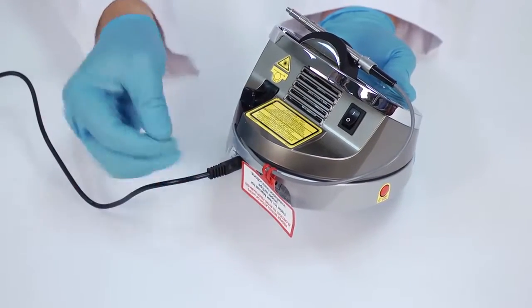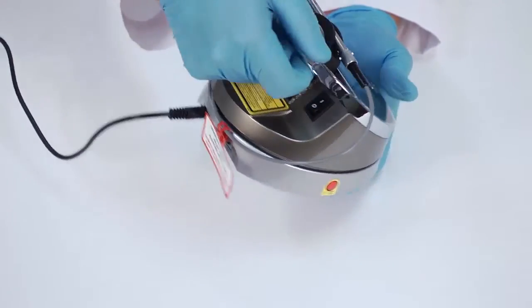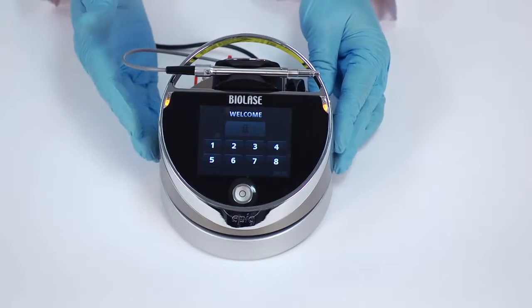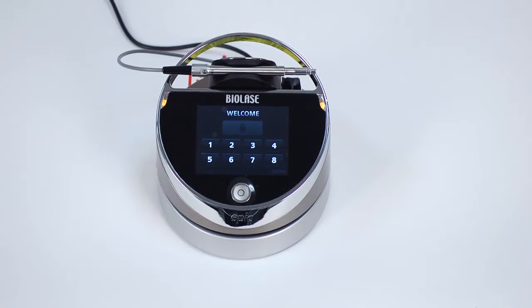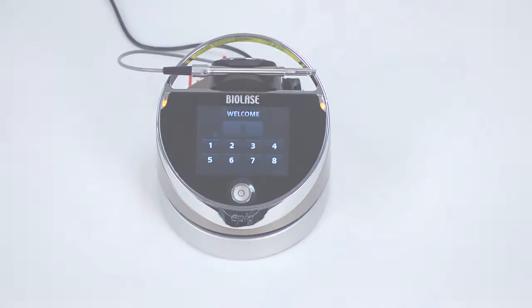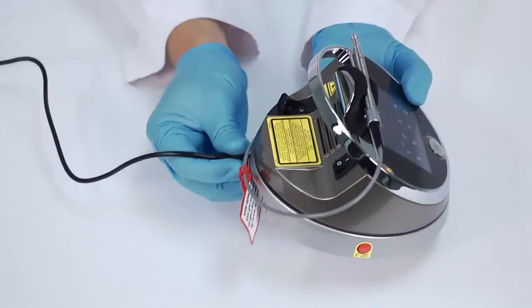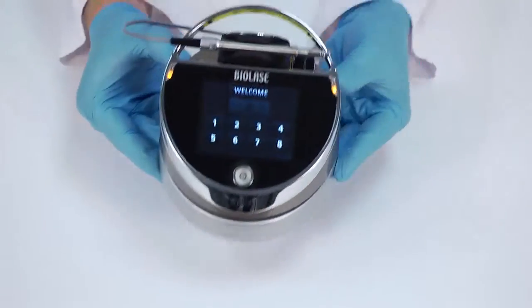To fully charge the battery, plug the power supply in and then turn the laser console on at the power switch. The laser console will start to charge and the unit will go into sleep mode, with the screen off, after 5 minutes. If the power supply is plugged in but turned off at the power switch, the battery will still charge but at a slower rate. Once the battery is charged, unplug the power cord from the wall outlet and the laser console. The laser console will run on battery power alone.